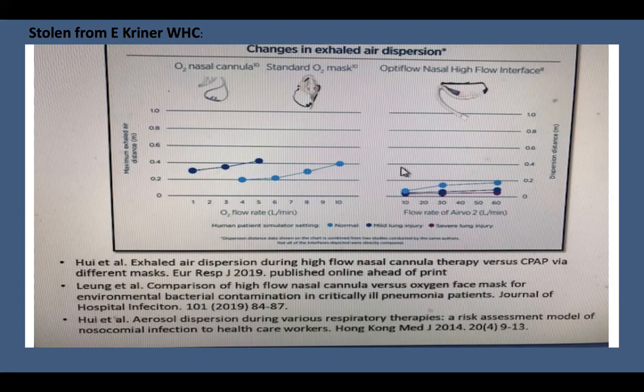That being said, those patients on high-flow nasal cannula have been shown to have 0.5 meter greater cough distance, which is why the manufacturer for high-flow devices recommends a surgical mask over the nasal cannula. What we've been doing routinely is using a tight-fitting non-rebreather for both cough mitigation and also during entrainment of ambient air, so that at least that ambient air is oxygen rich.